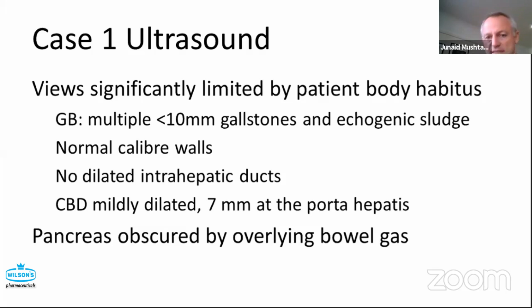But my problem is this: when you start to look at the images, you realize that what the radiologist says in the first sentence is absolutely right. When they say view significantly limited, it is a shocker when you actually look at the images and you can hardly see anything.